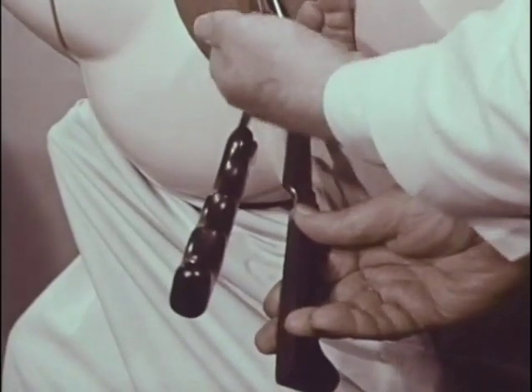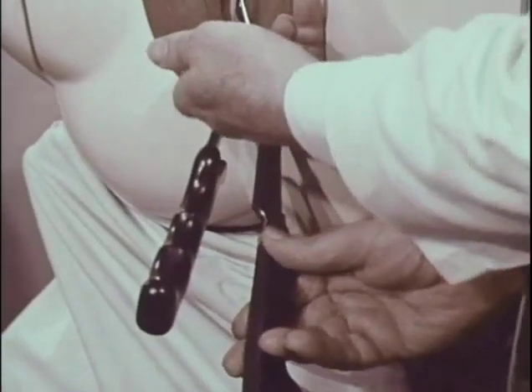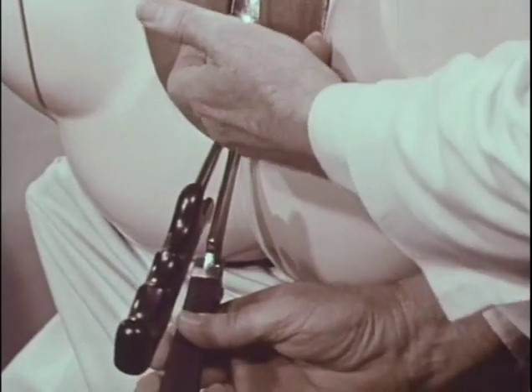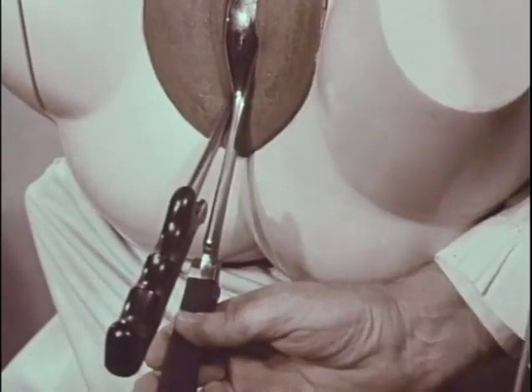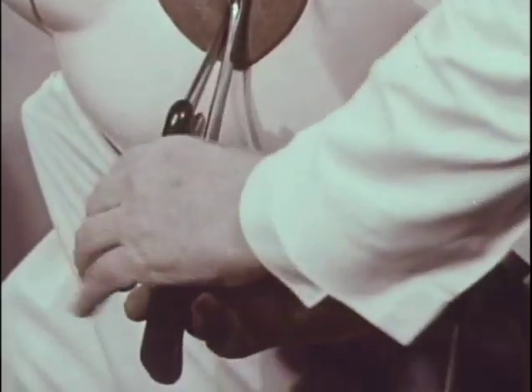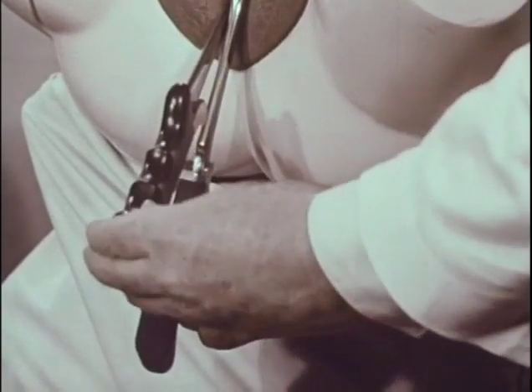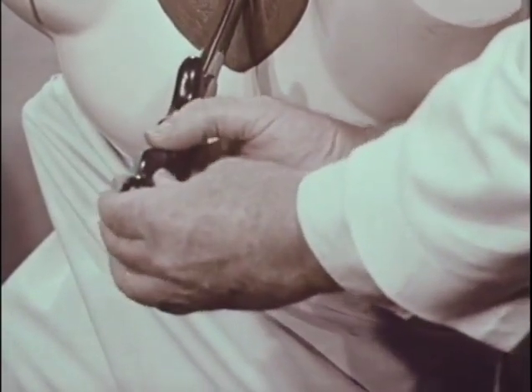And now comes the wandering maneuver with the middle finger replacing the thumb at the heel, lifting that blade around under the symphysis, opposite the anterior cheek. And the handle will be considerably lower than that of the posterior blade already applied, but locking is accomplished readily by simply elevating to the locking level.